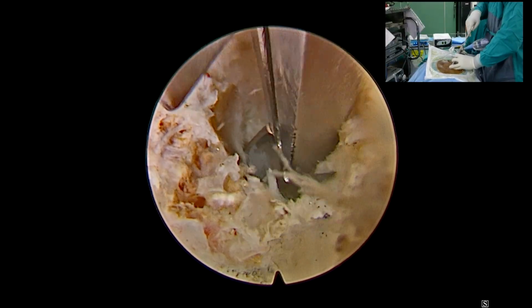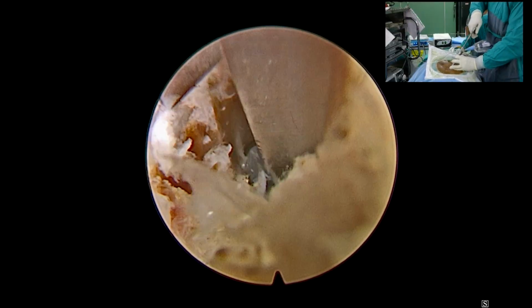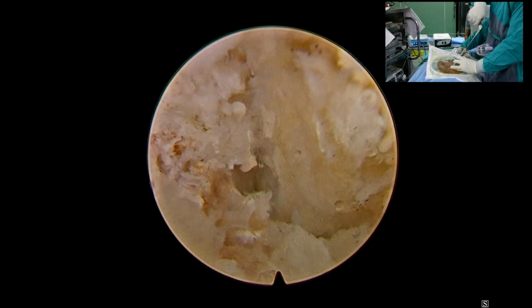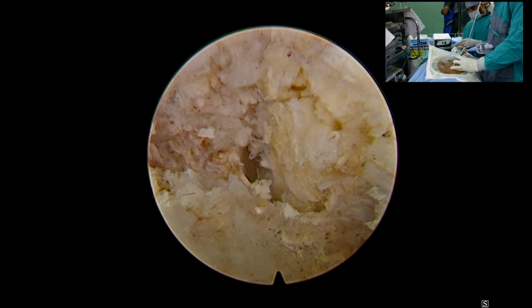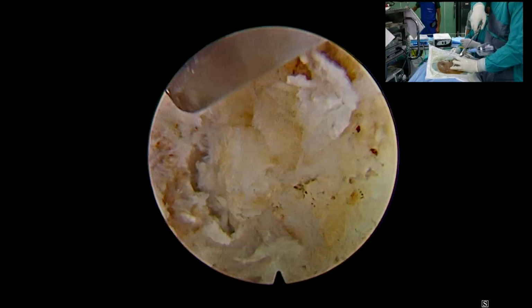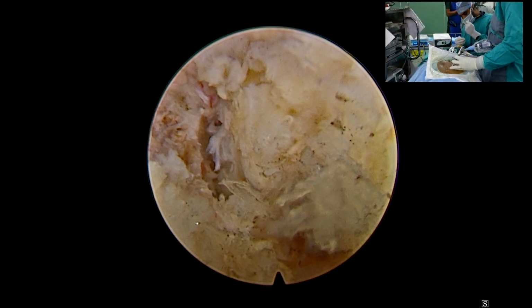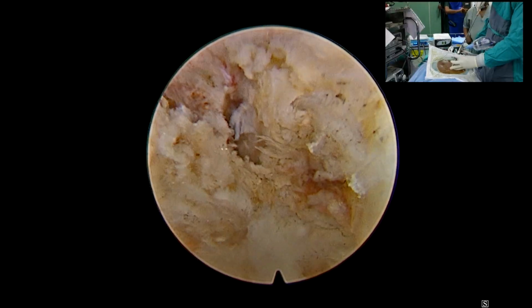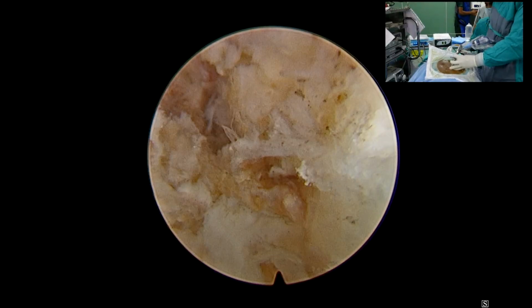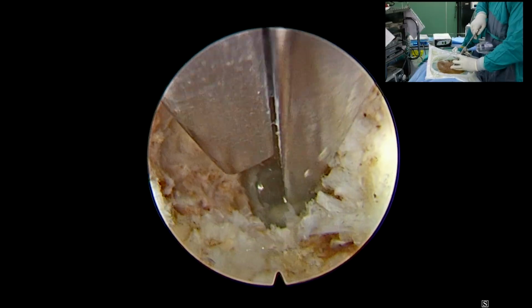We can see the direction of the hand to know the structure which we are nibbling. Our hand is slightly towards the operating side, and we are looking towards the spinous process. So what we are nibbling must be the upper lamina.